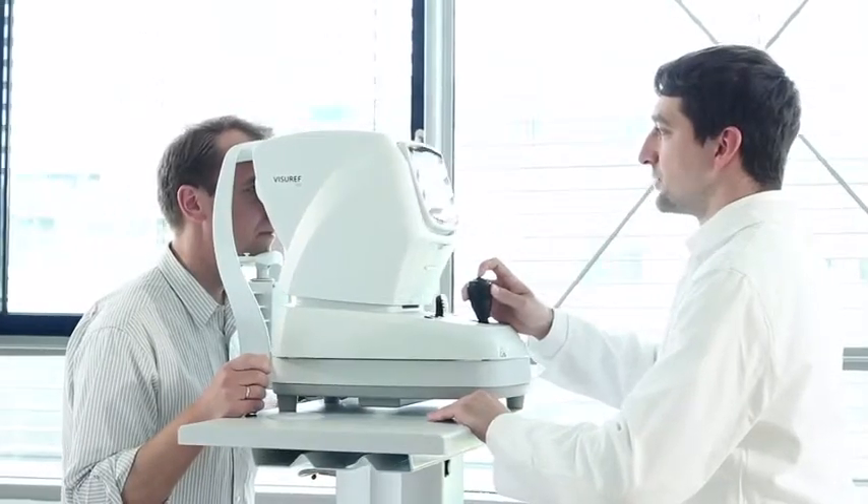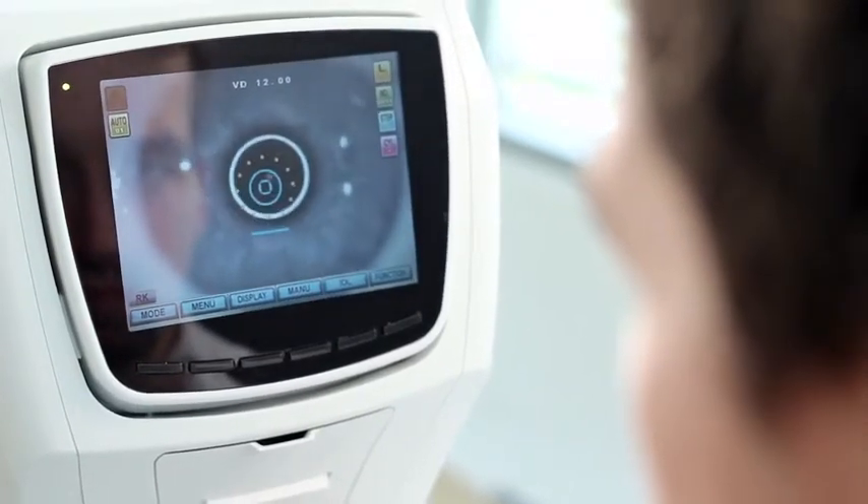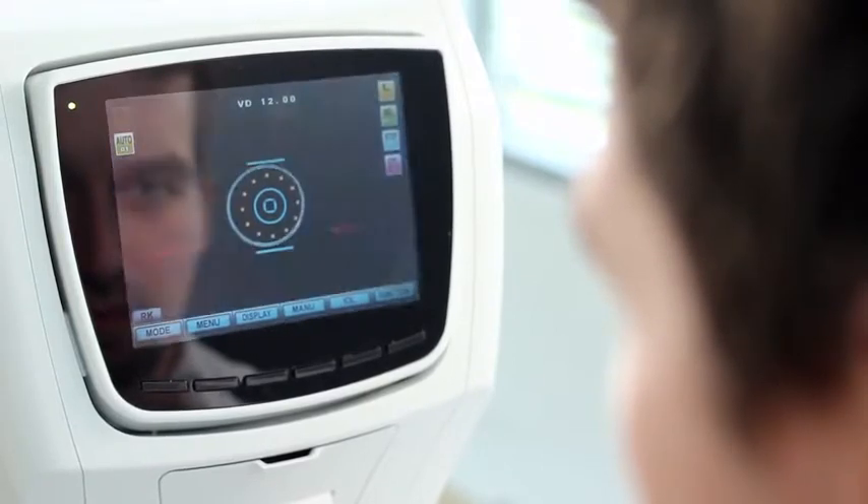Focus the device on the patient's eye using the targeting function on the live screen. In auto-trigger mode, the refraction will automatically begin once the device is in focus, taking one or several measurements. The results are immediately displayed on screen.